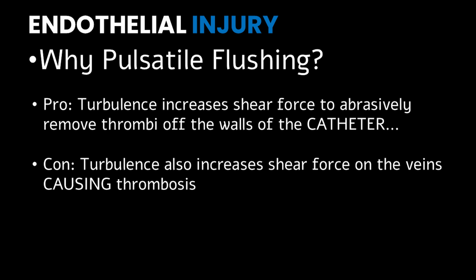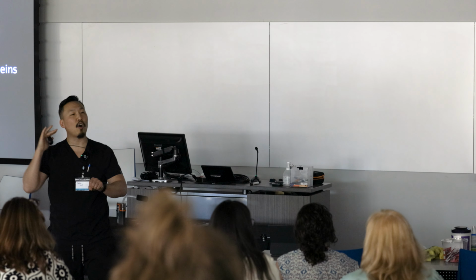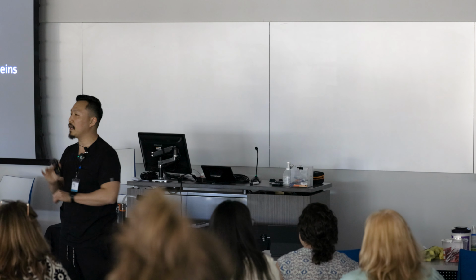Why pulsatile flushing? We do pulsatile flushing because what happens if you hard push a CVC or a PICC line? What does it do to the catheter negatively? Turbulence, yes. I love it. The only one that read.